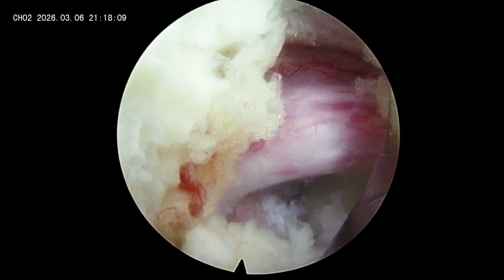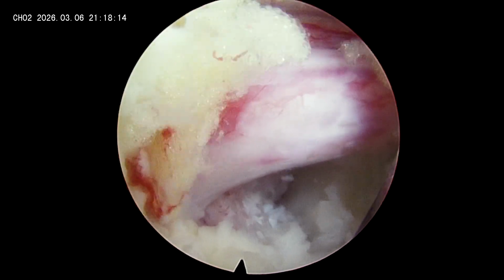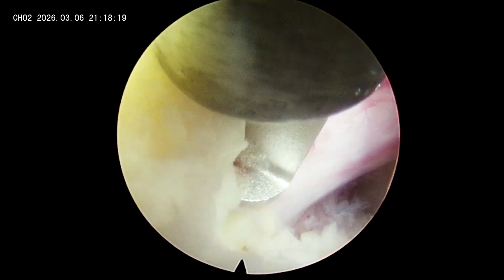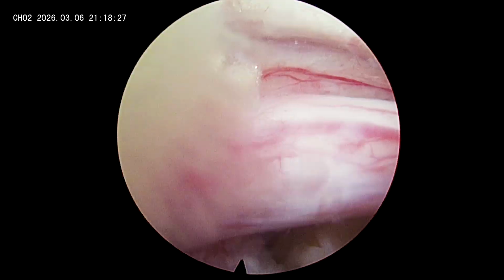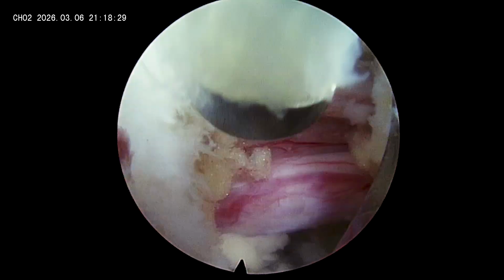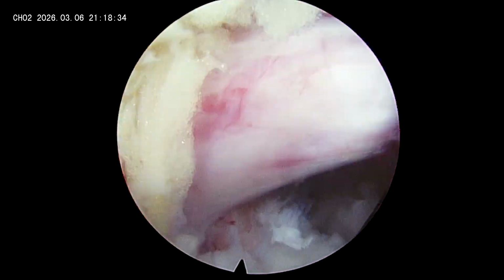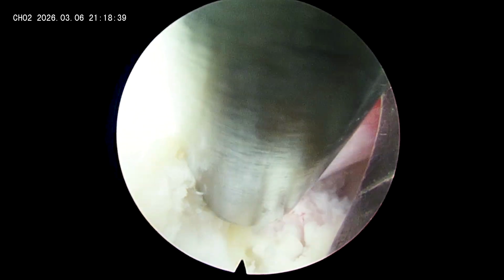Something you sometimes get is some epidural vessels which are adherent to the root, and you can see here the mobility of the root has been hampered because of that particular small vessel. So I'm not able to retract the lower part of the root medially. So I'm just going to remove a little bit more flavum, and try to cut that vessel so as to get a mobile root.